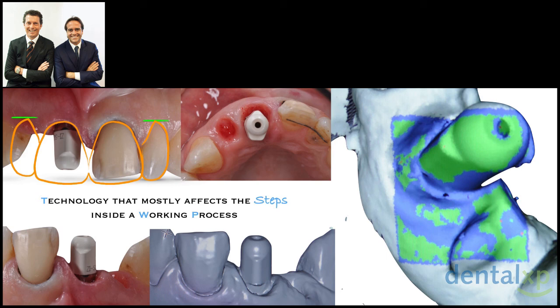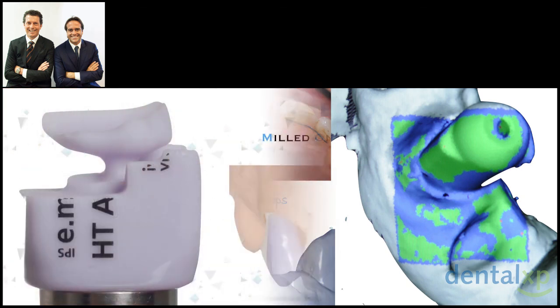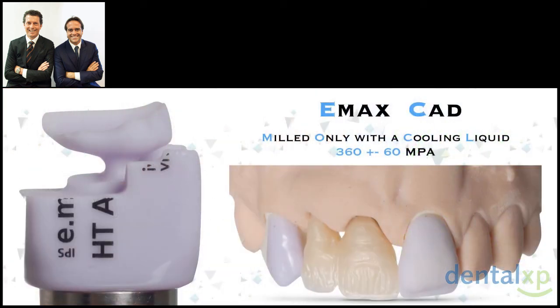We already said that we will incorporate number 21 and number 13 to manage prosthetically the huge prosthetic space, and we needed to do what? We needed to create a model. Yes, then the dental technician workflow moves on, starting from the base of the provisional restoration, shaping his digital project and then producing a model in a completely digital environment.